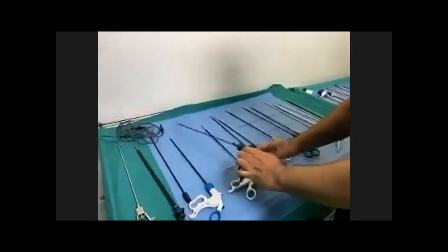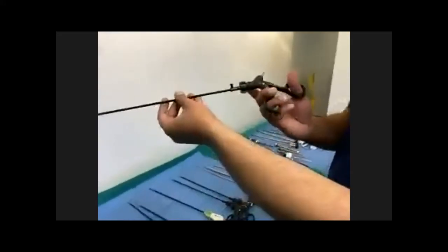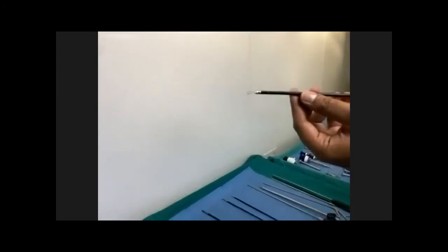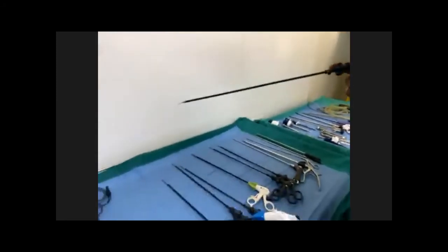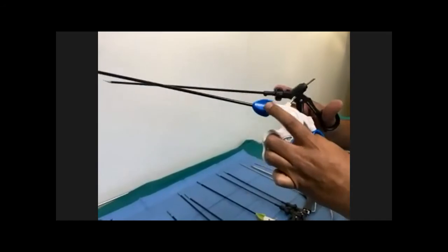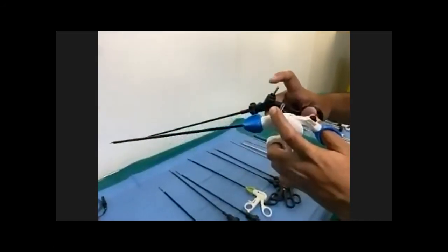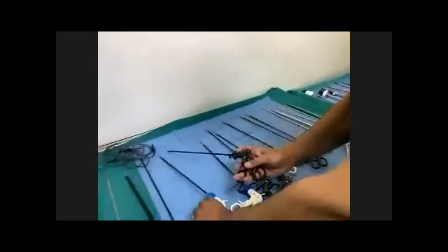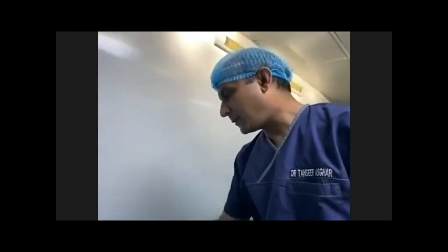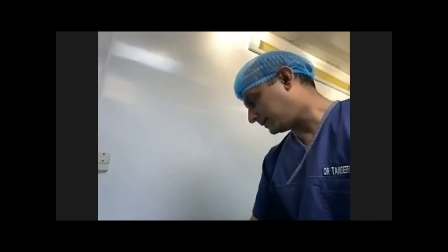Okay, this is an endoscissor. You can see the shape of the scissor. The scissors also have different shapes at the tip. Some are curved, some are straight, right? This is a reusable instrument. This is a disposable instrument. Both have rotating heads, right? And both have cautery places to be attached. Basically, it is used for cutting, for example, the cystic duct, or any other viscera like the base of the appendix, or it can be used in the bowel as well.